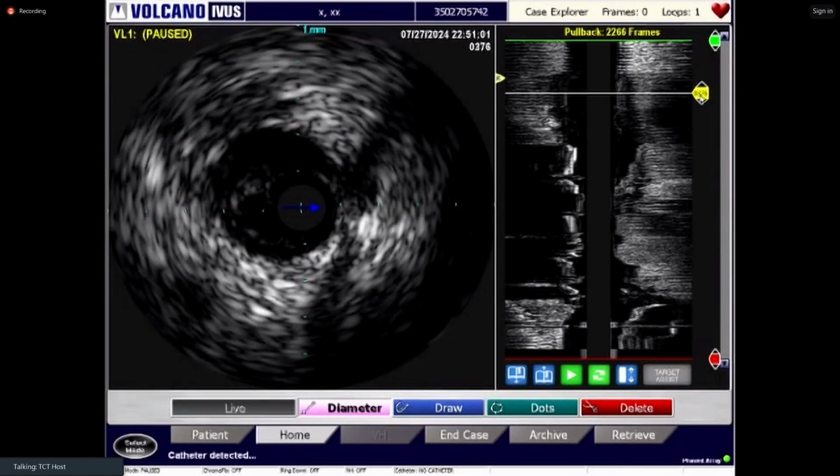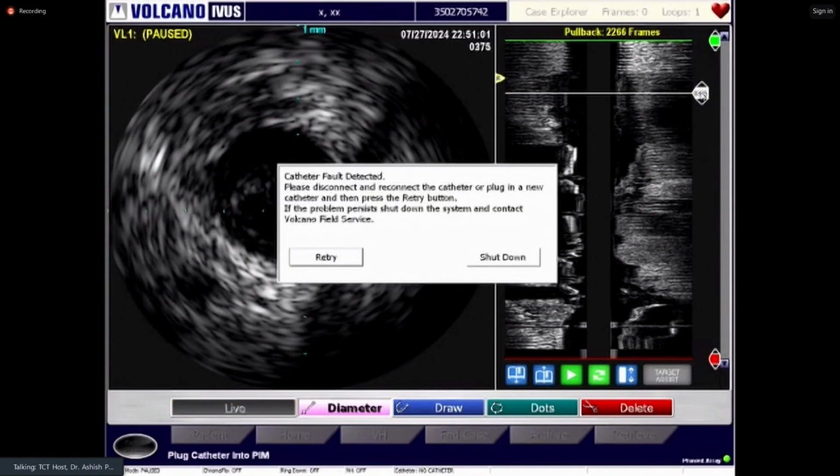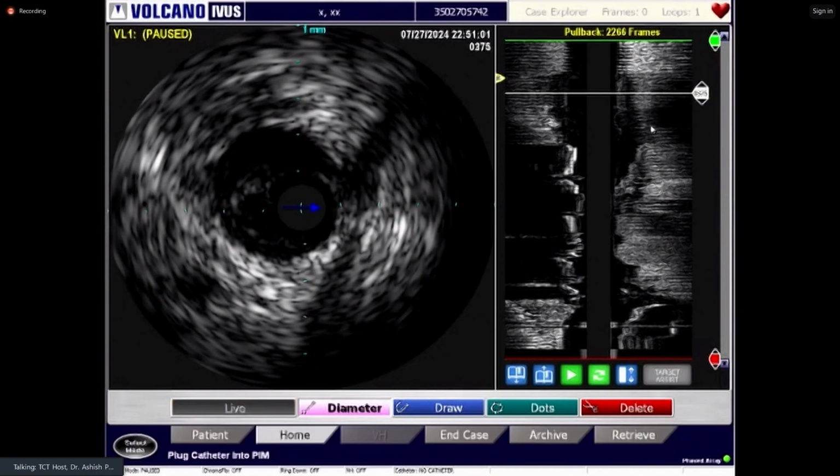Okay, go back. Because we are in the true lumen distally, who cares? You know that tissue plane, Akiko, is it above it? We were wondering whether or not it was true. Is that potentially the hematoma? No, it's subintimal, good. Is that the space created by the antegrade microcatheter when it was subintimal in the first place?